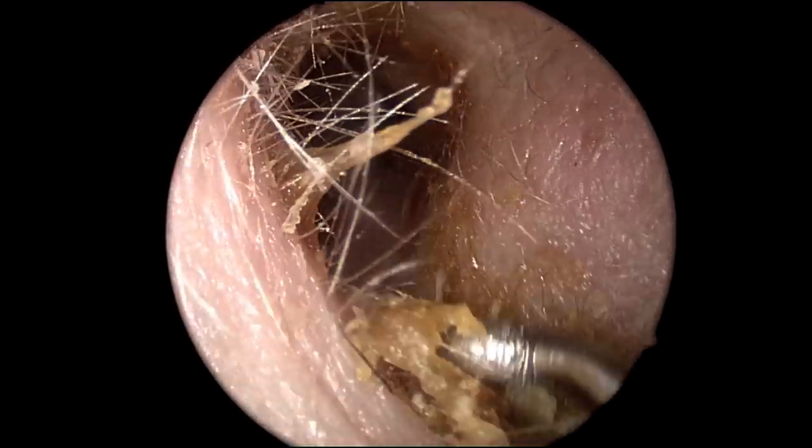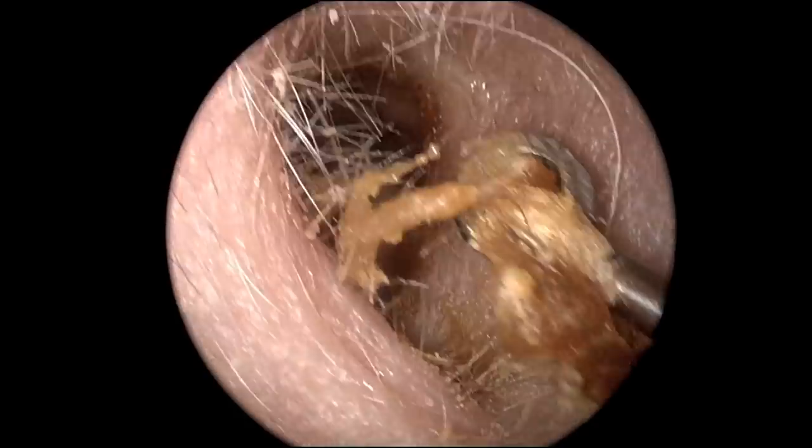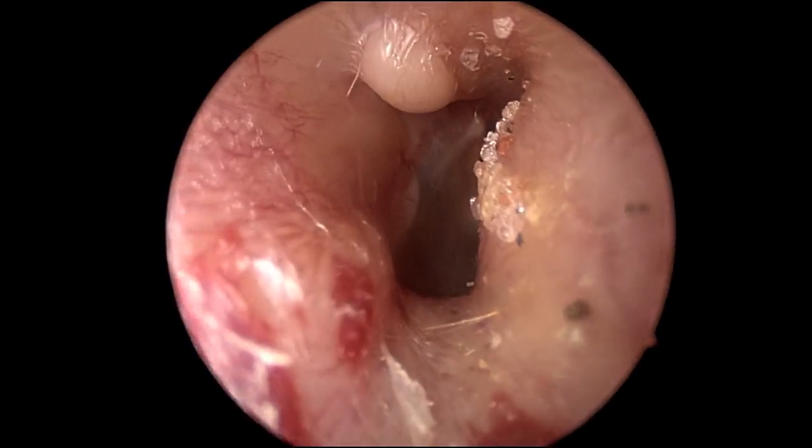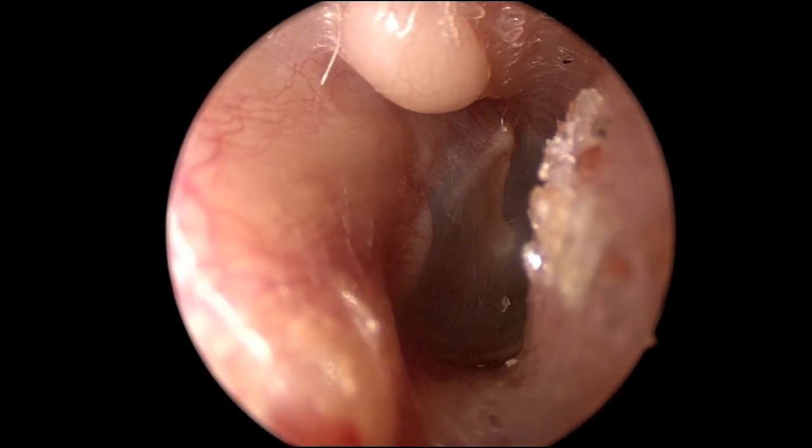Some patients require cerumen removal on a regular basis. Taking a look distally, we see a normal eardrum.